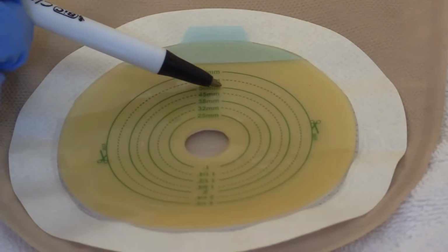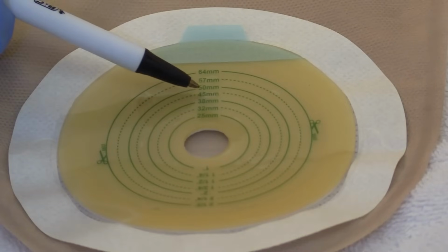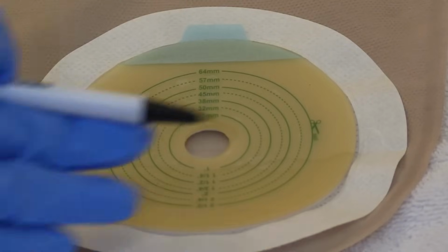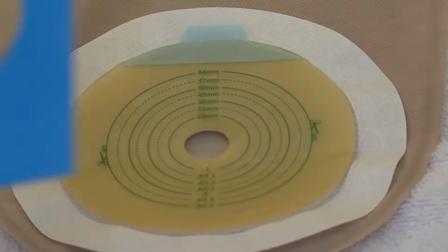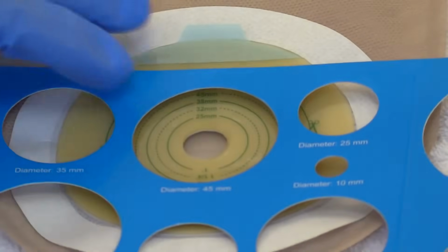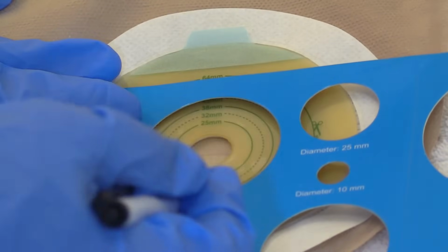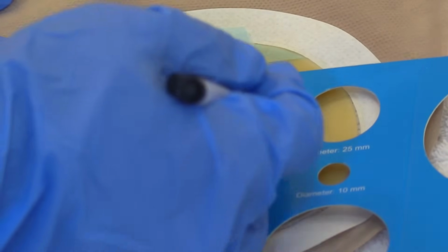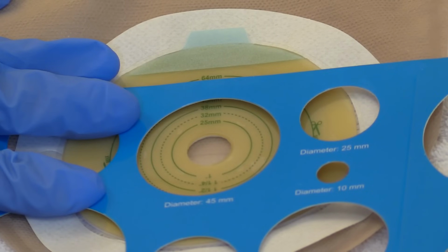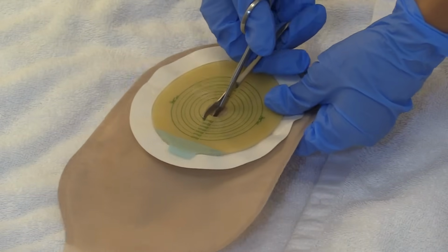Now, some skin barriers are already labeled and they have a nice little outline of where your measurement is. Like here, it already says 45 millimeters, so I don't have to trace it. But sometimes skin barriers don't have that. So what you would have to do is put your measuring card over it and trace where you had your measurement. So you would find the 45 millimeter and you would just create a circle on the barrier and then cut it out. Now I'm going to take my ostomy scissors and I'm going to cut around the 45 millimeter mark.